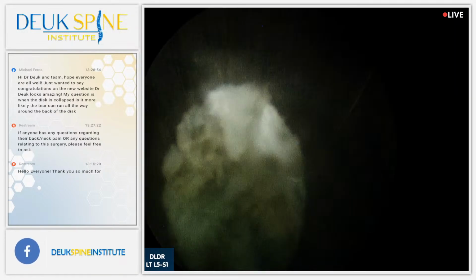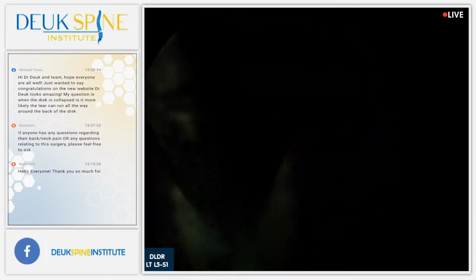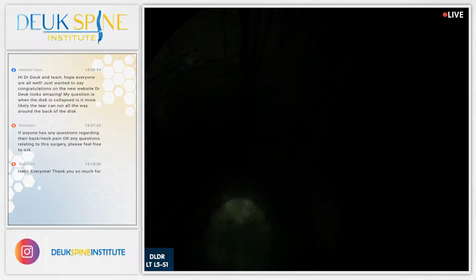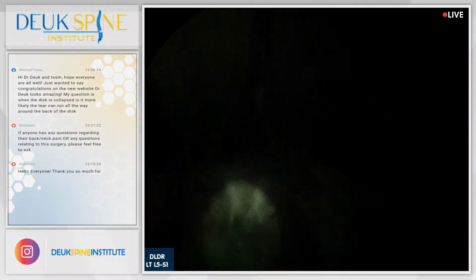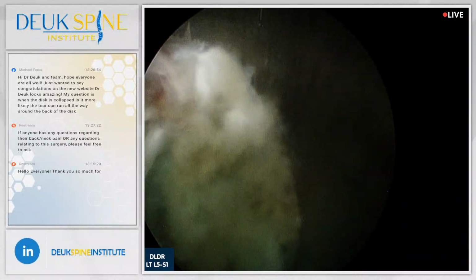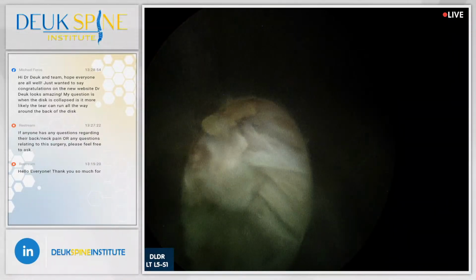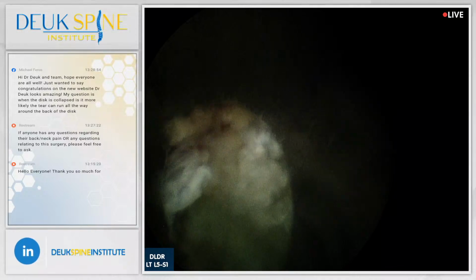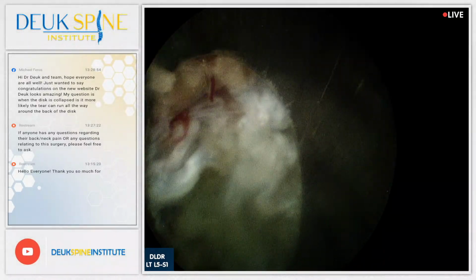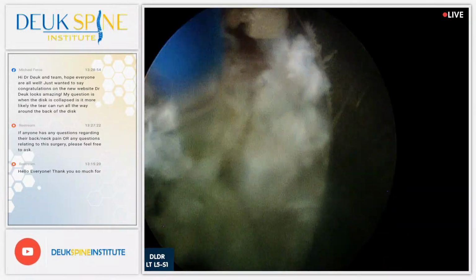All right, we've shown the 30 causes of back pain. We've shown how a herniated disc causes chronic back pain, laser. Correct. We've shown how the laser works, right? Correct. There's the inflammatory tissue right there. It's pink. You guys see that? That's where all the back pain comes from. We're going to go clean it up.